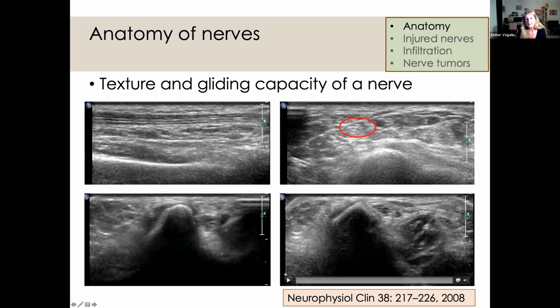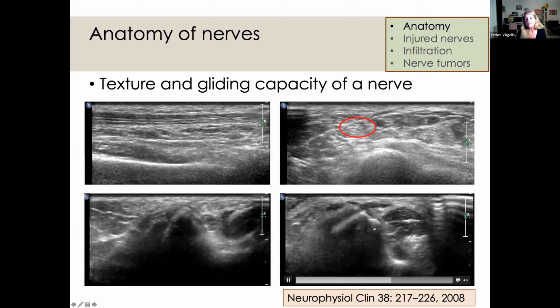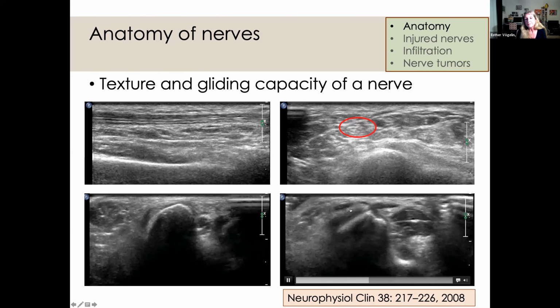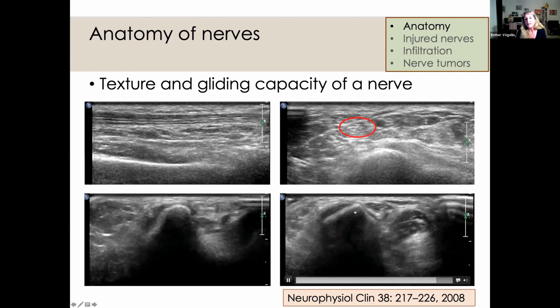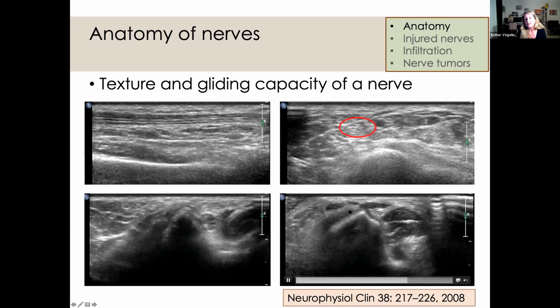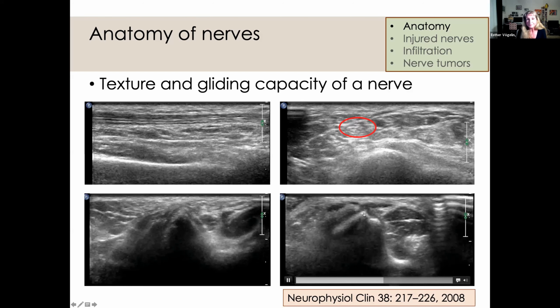When you look at this example, you see a more flat sulcus, and you see what this nerve is doing. It is jumping over the medial epicondyle, and everybody can gather that this nerve is not quite happy doing this all the time during flexion and extension.